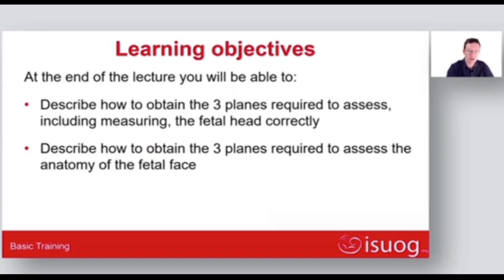The objective of this lecture is to describe how to examine the head. I will describe how to obtain the 3 planes required to assess the head and the 3 planes required to assess the face.